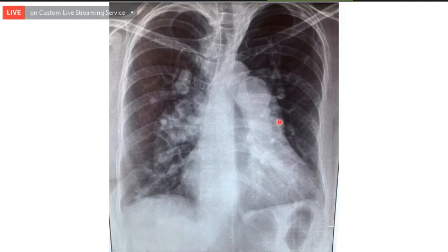It is either normal or a little prominent, sir. See, there is a limitation in interpreting the right atrial border, because it is slightly rotated. But looking at the X-ray, it seems that RA is not enlarged. Now I can see the unfolding of the arch on the right border, sir. Arch of aorta is seen. It is not SVC, sir. It is aorta unfolding, should I say, sir? I don't think I can very prominently see aorta. Okay, sir. No comment about that.